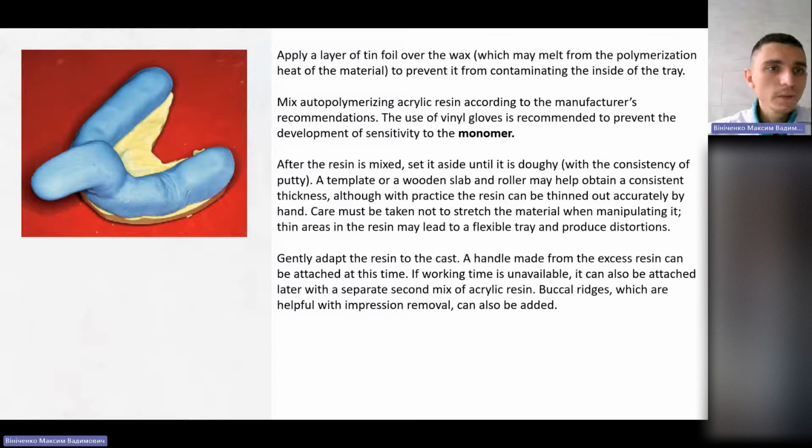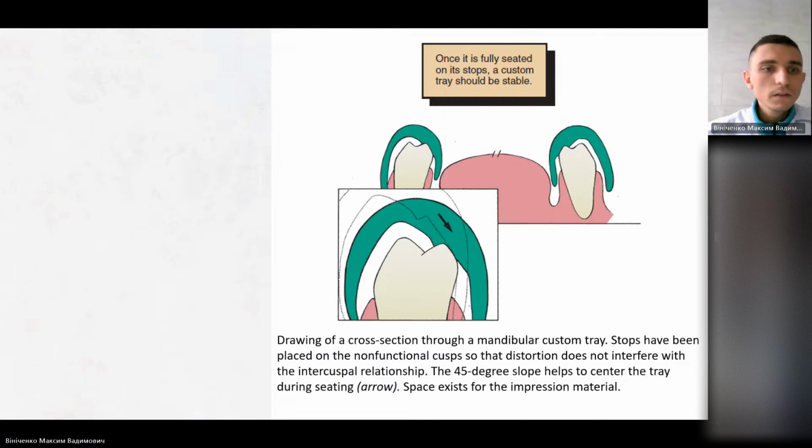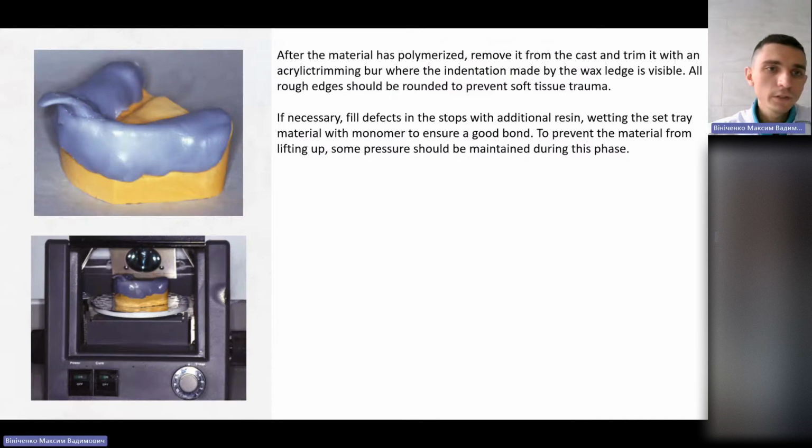So here is the custom tray on the cast. Here in Morocco, it's not made by the dentist. It's more made by the prosthetist, in the laboratory. Yes, in Zaporizhzhia, it is also mostly made in the laboratory.